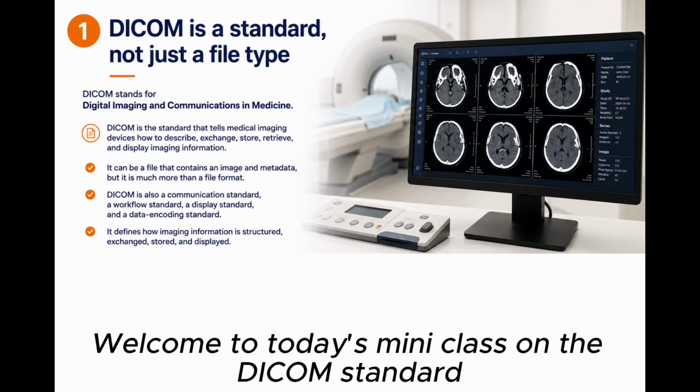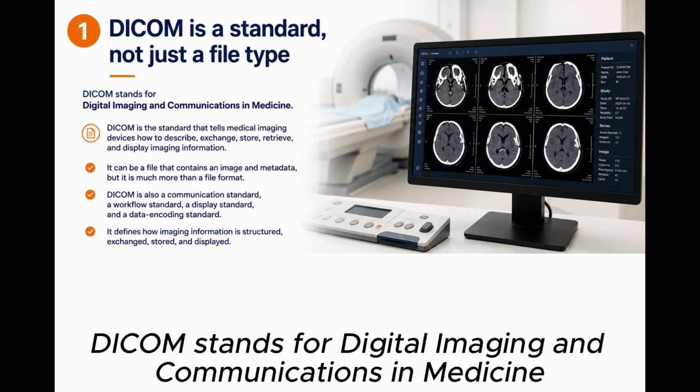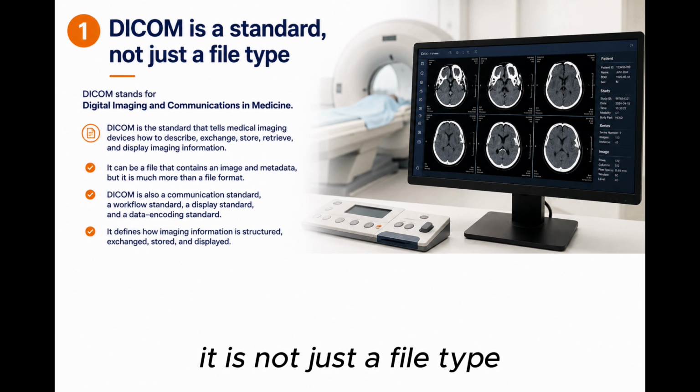Today's mini class on the DICOM standard. Let's start with the obvious. DICOM stands for Digital Imaging and Communications in Medicine. And contrary to popular belief, it is not just the file type.